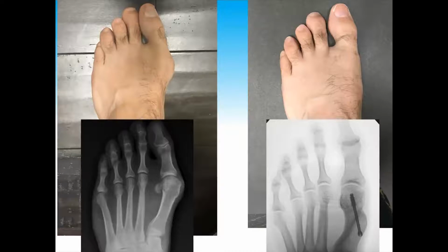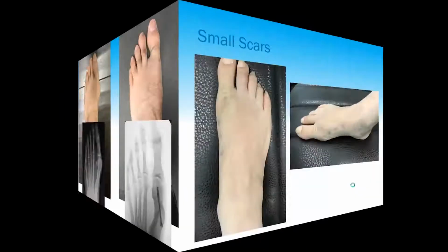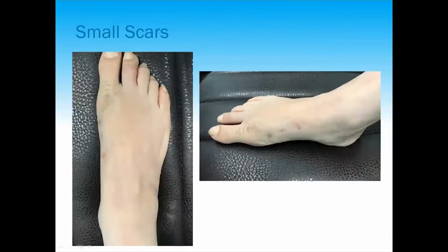So that really helped with correction. Soft tissue rebalancing through percutaneous incision was also done. So this modified technique basically allowed for internal fixation, which is more rigid fixation, and also some soft tissue balancing procedures with a few small incisions medially.